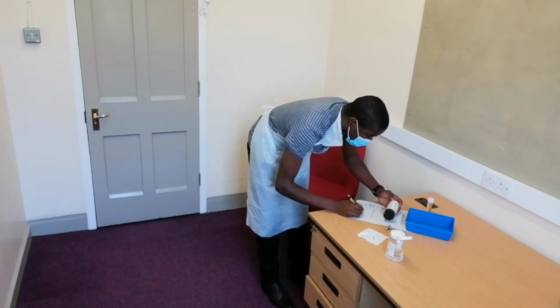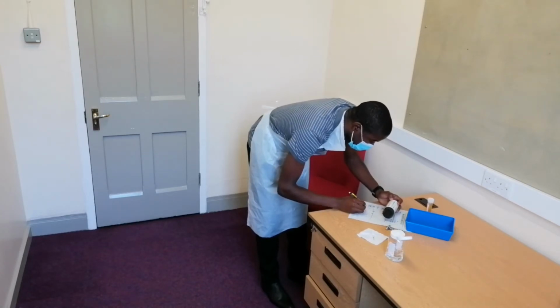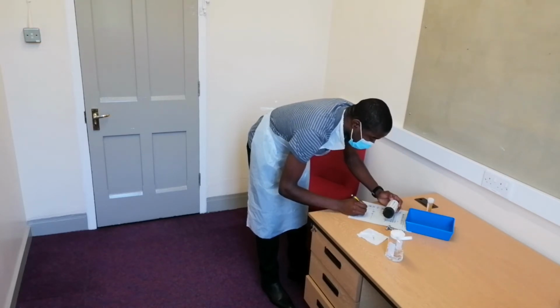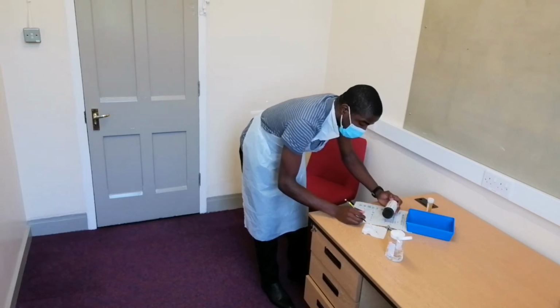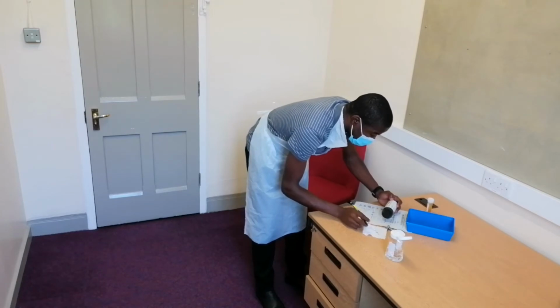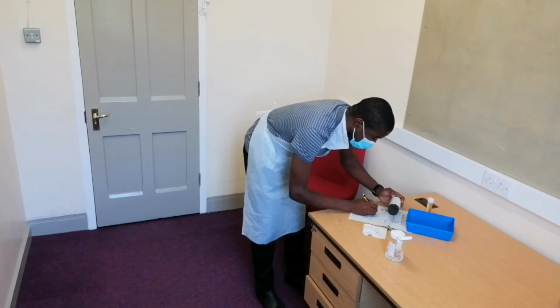I wait for a further 10 seconds to read the ketones. The 30 seconds are over. I wait for 5 seconds for the specific gravity. Okay, I have the specific gravity. Okay. I wait for a further 15 seconds to read the blood, and the blood there is 60 seconds.